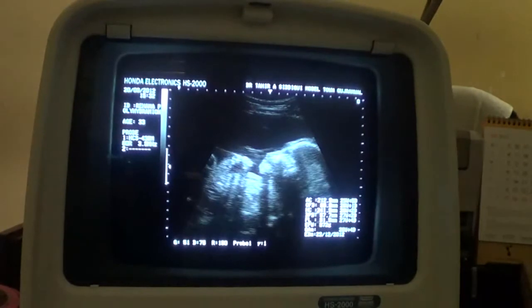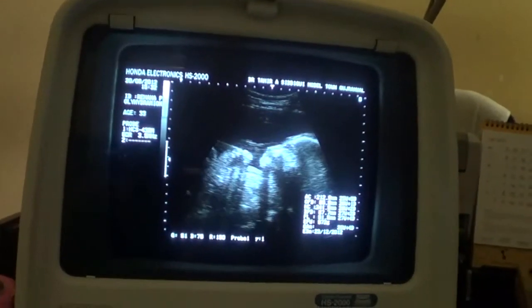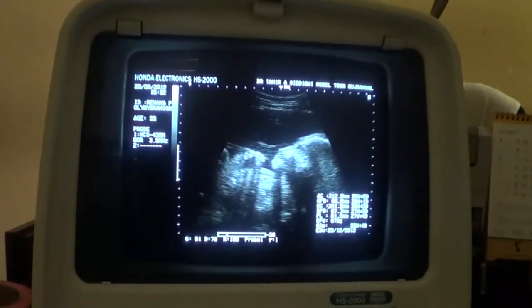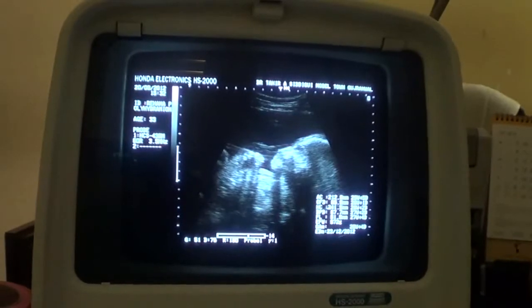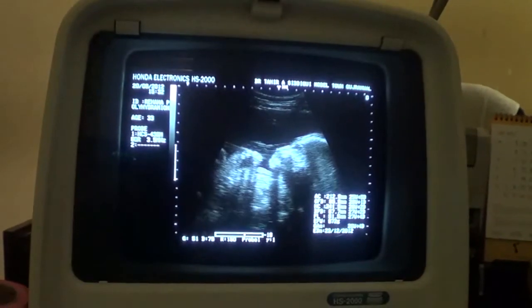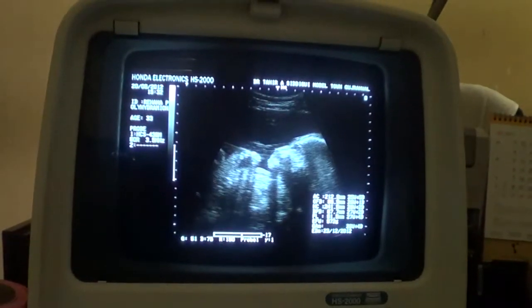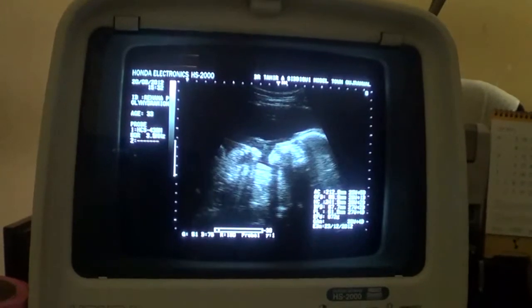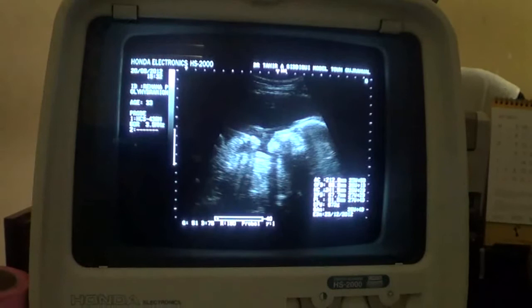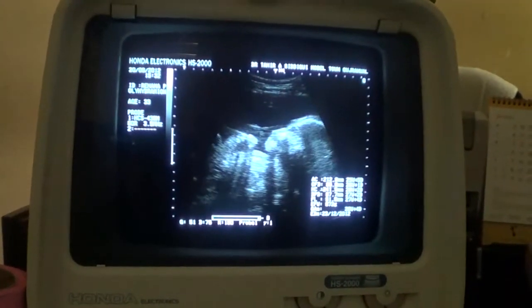As we went on performing the ultrasound, we have come to another very different conclusion, that this is a case of intrauterine fetal demise at 26 weeks gestational age, and polyhydramnios because of the same reason. And the cause is the beaded or knotted umbilical cord.